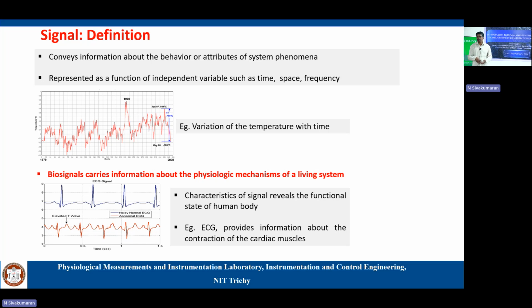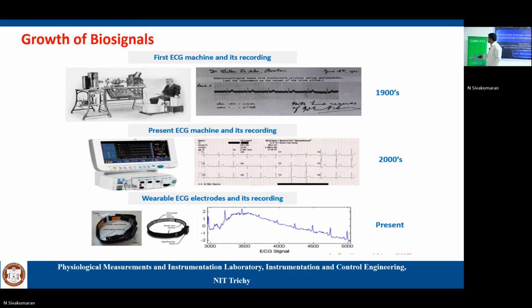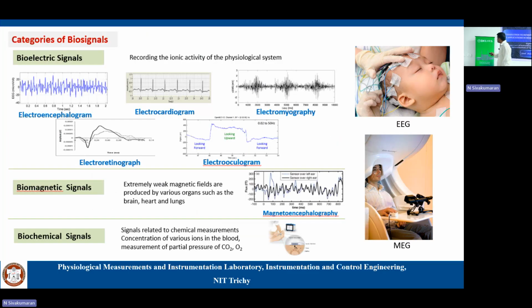Okay, we have the FDA. Those devices should be approved by the FDA. As far as safety concerns, there are some safety standards that have to be met, and safety in both senses. For example, safety to the human being, and safety to the data.